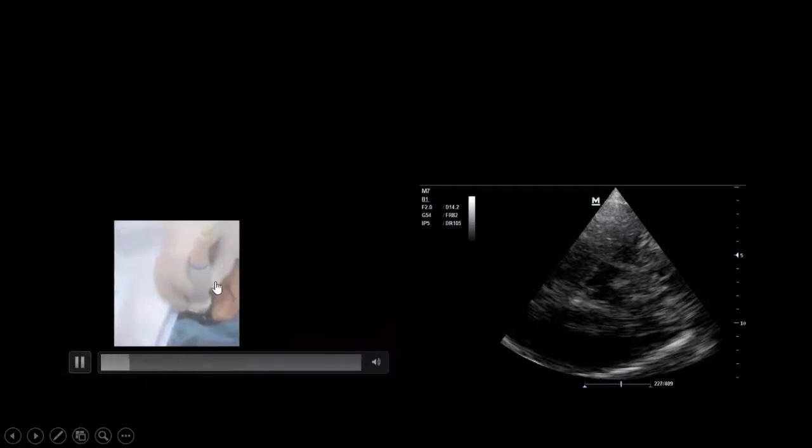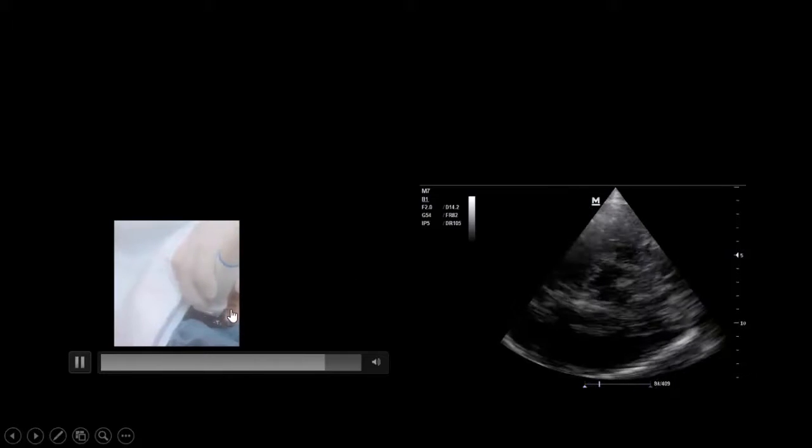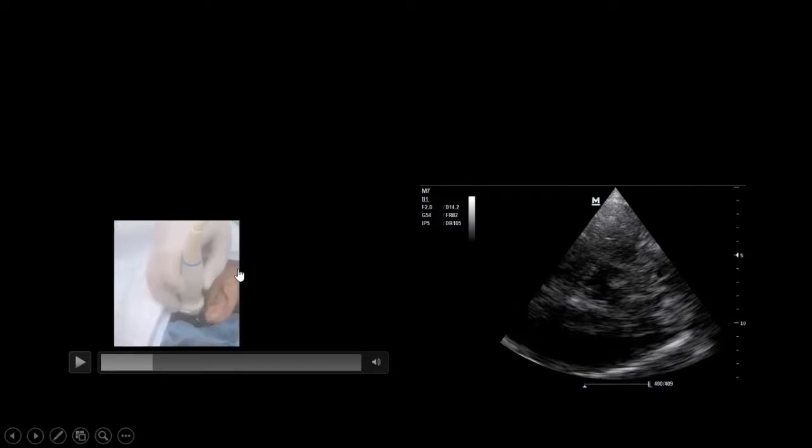Here is the actual position of the phased array probe. I am now examining the left side; the patient looks to the left side and I place the phased array probe with the mark positioned posteriorly, matched with the screen mark. This position is in front of the ear, above the zygomatic bone — this is the actual position above the zygomatic arch.